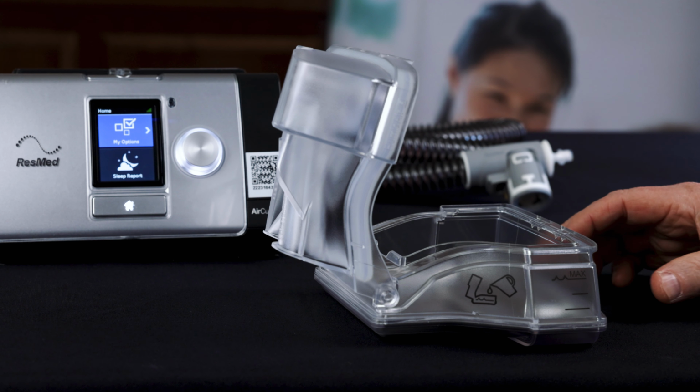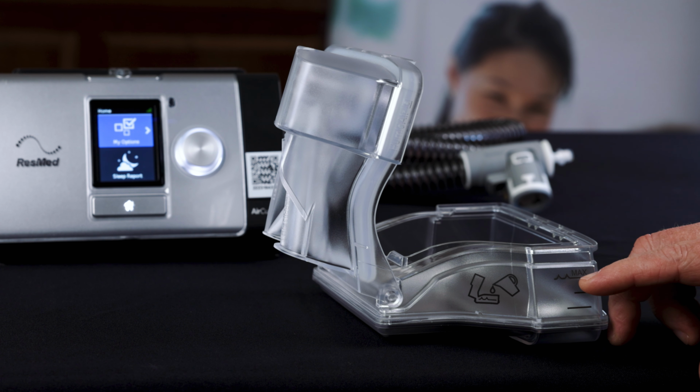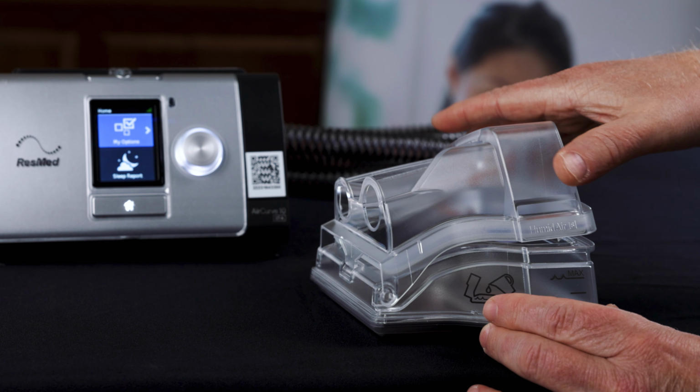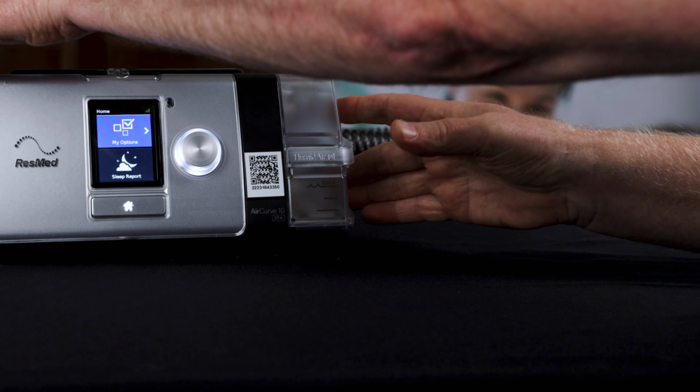So once you fill this chamber up, make sure you always fill it just a little bit below the max line. The reason being is if you overfill it, you could potentially damage the machine. So once you fill it, just close the lid till it clicks, then slide it back into place.